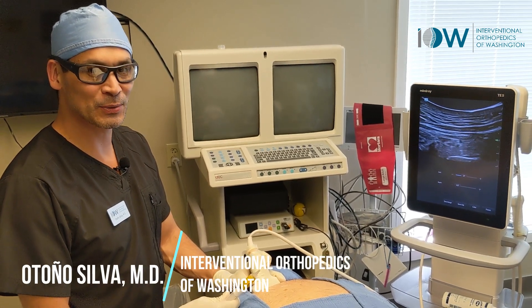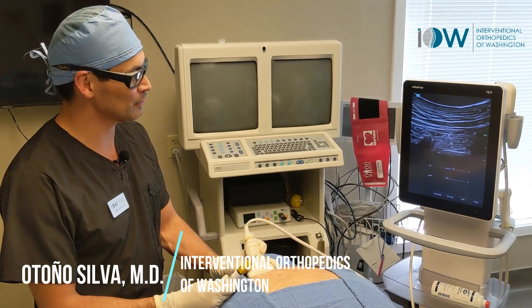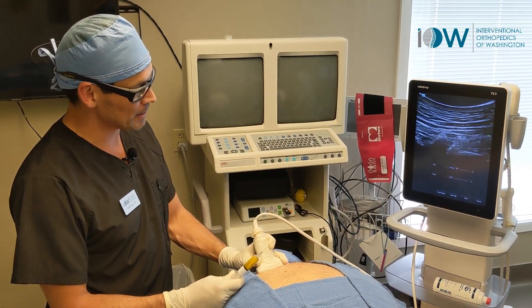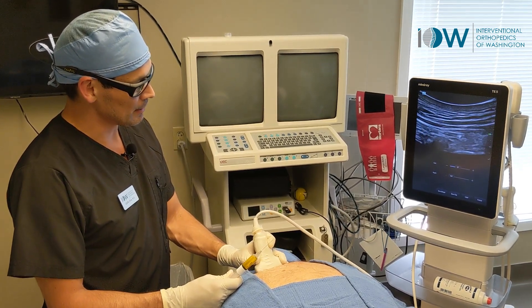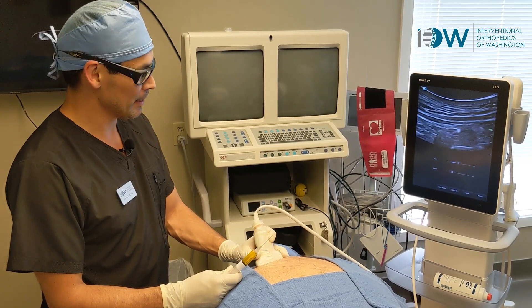Dr. Silva here at Interventional Orthopedics of Washington, where we're doing injections into the costovertebral joint. Here on the left side, this patient has some back pain and is experiencing it localized upon palpation.